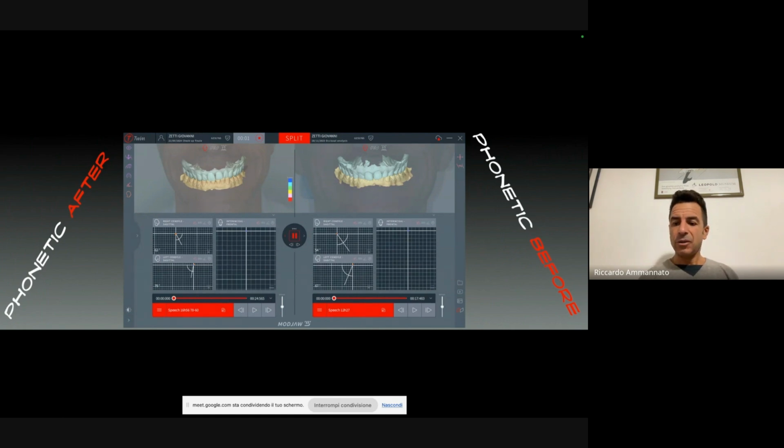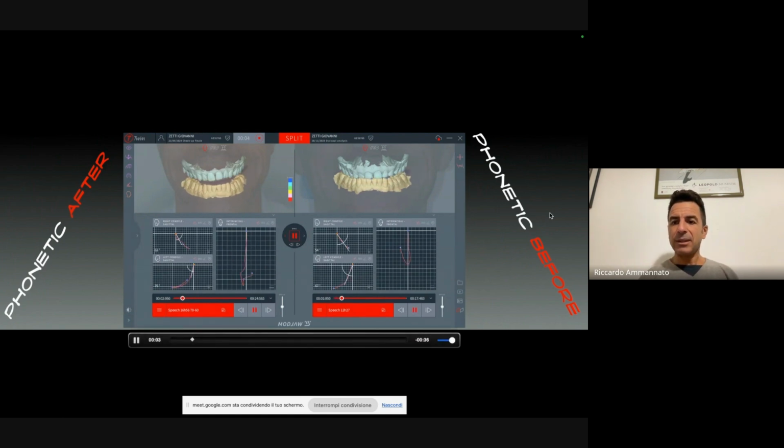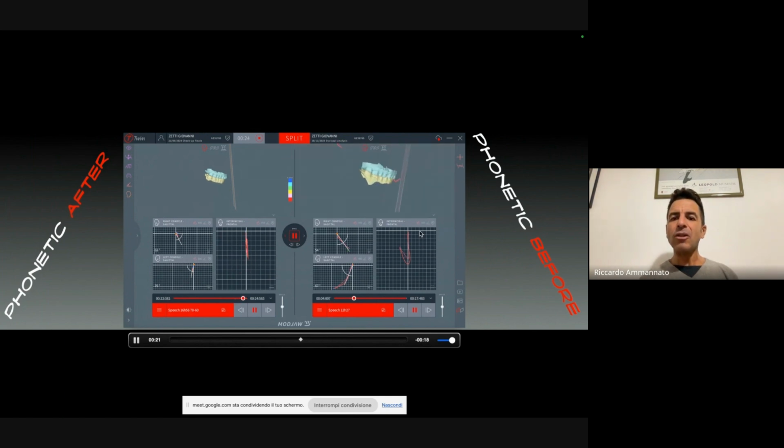And we did here a final module here, the jaw tracking, and you see here, this is before on the right, before the restoration, and this is after. But if you see the movements during the speech, because he is talking here, like I'm doing now, and you can see this was done 3-4 months after the restoration was performed, and here he is not so balanced.